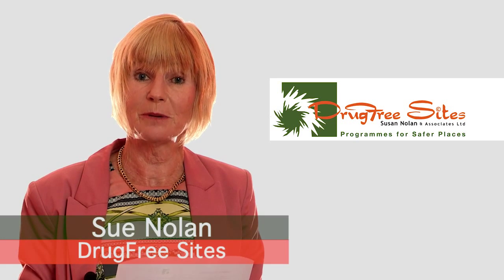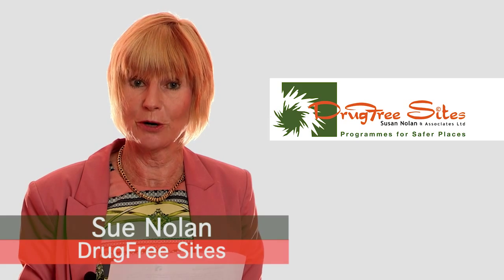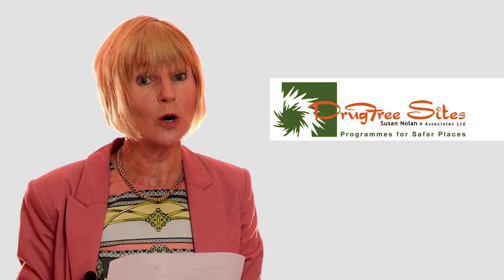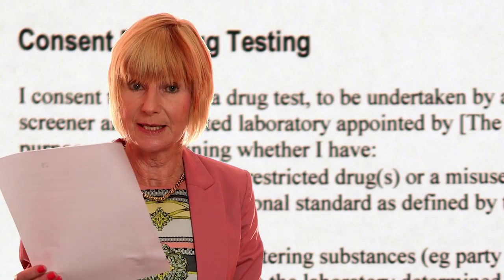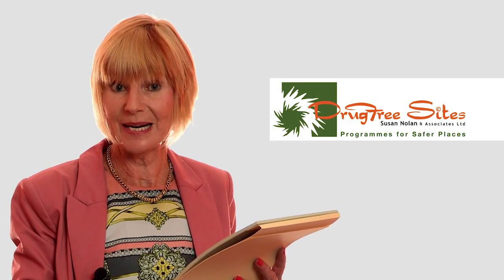I am now going to demonstrate the urine on-site drug screening process. Now, as with alcohol testing, you will be required to present the collector with a signed copy of the consent for drug testing form. In your presence, the collector will complete a chain of custody form.